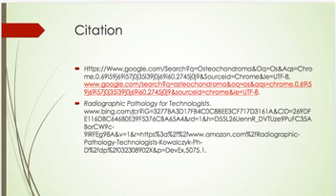Also, I provided patient care, especially for a young adult: shielding and collimation on all 4 sides. Also, communicate gently, ask the patient gently, and be friendly with him or her.